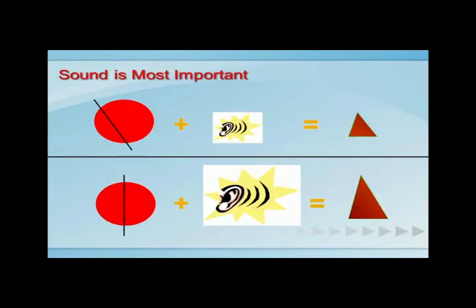The sound is the most important factor while positioning the ultrasound probe and focusing. You want to hear a high-pitched sound of blood flow leaving the descending aorta.